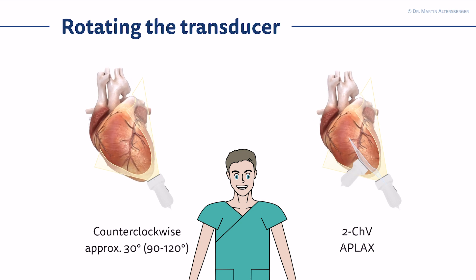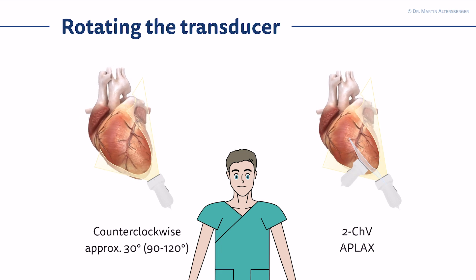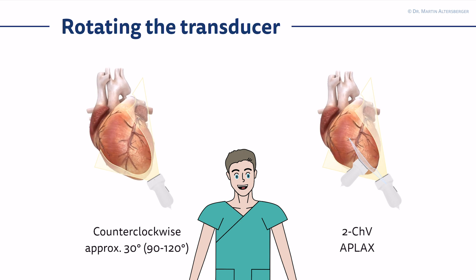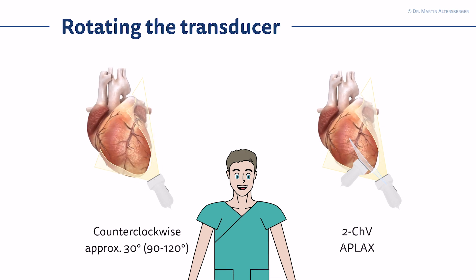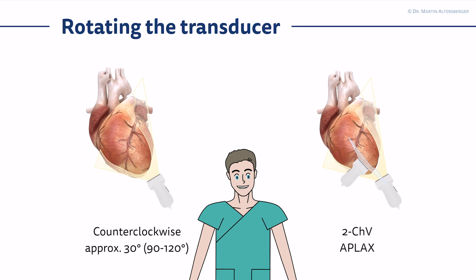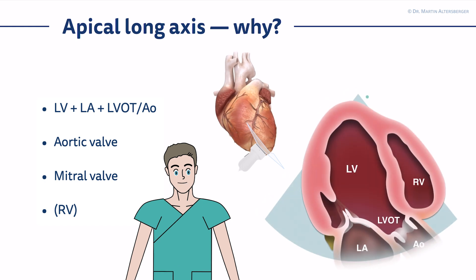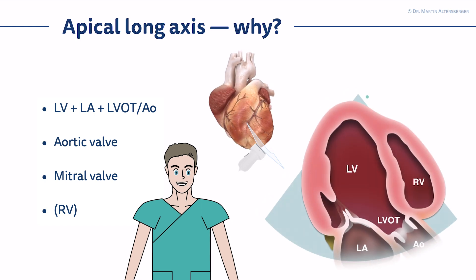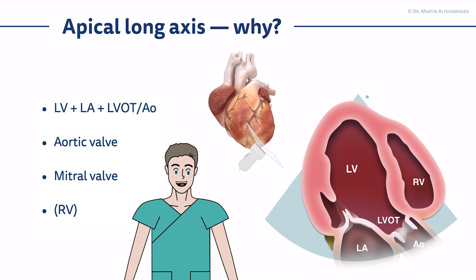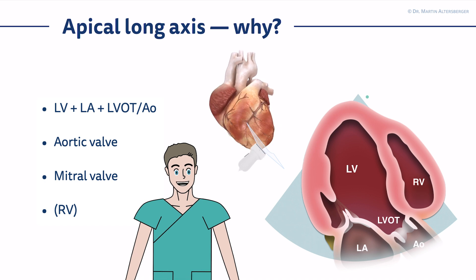Continuing from the two-chamber view with a counterclockwise rotation of approximately 30 degrees — overall from the four-chamber view, it's 90 to 120 degrees — you are then seeing the apical long axis view. In the apical long axis view, you can see the left ventricle, the left atrium, the LVOT, the aortic valve, parts of the ascending aorta, the mitral valve, and to a lesser degree also the right ventricle, which is allowed to be in the field of view.